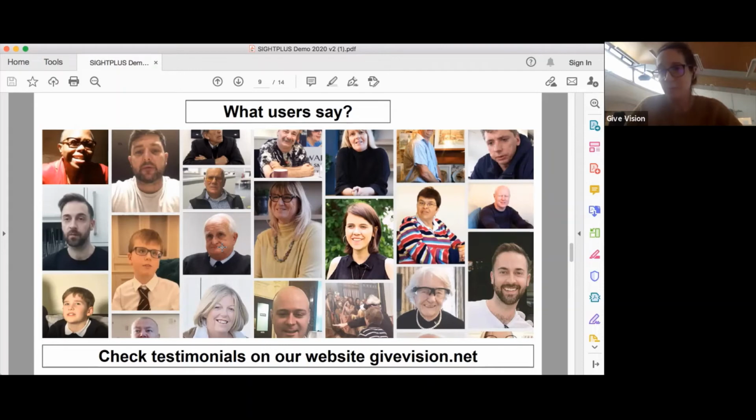For some people, it can feel heavy after a certain period of use. So we know this is a big thing that we can improve: how we can make it smaller. When we started working on it a few years ago, one of the main challenges was technical. It was really hard to make it small and embed a screen into a lens. But now we know that it's technically possible. We can do it. We can offer a bigger field of view than the one from Google Glass, for example.